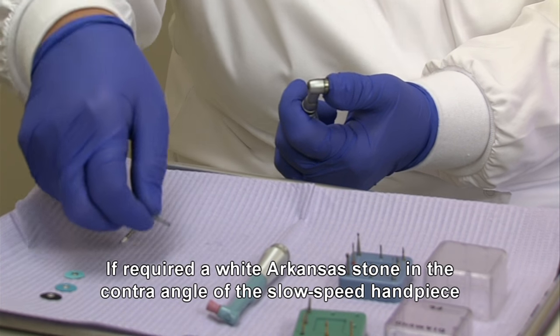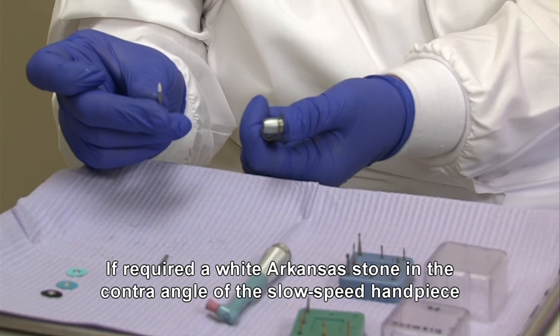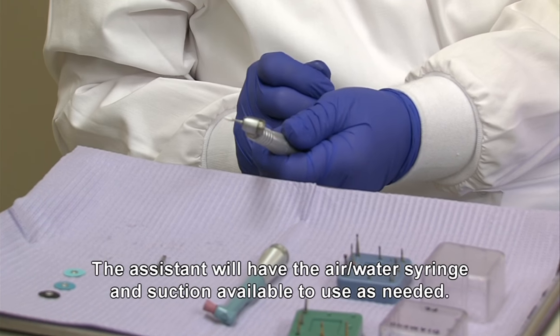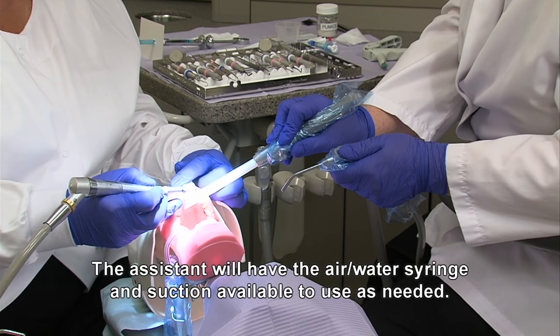If required, a white Arkansas stone in the contra angle of the slow speed handpiece may also be used for final polishing of the composite restoration. The assistant will have the air-water syringe and suction available to use as needed.